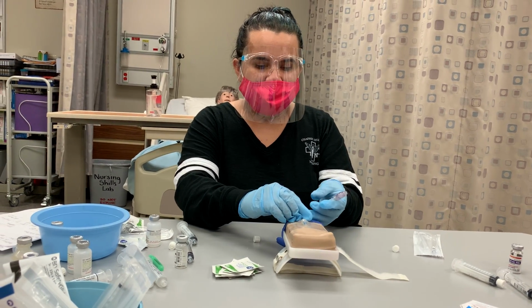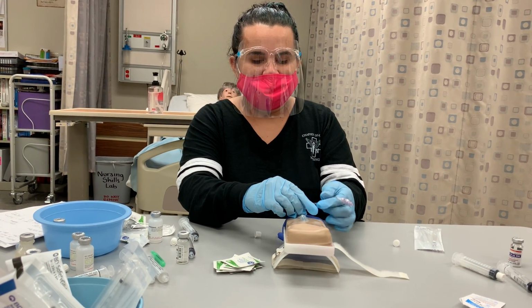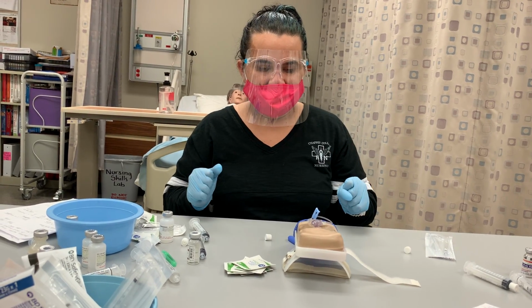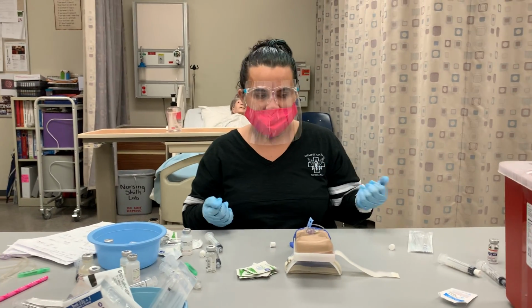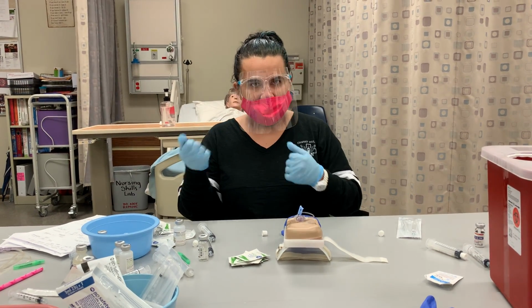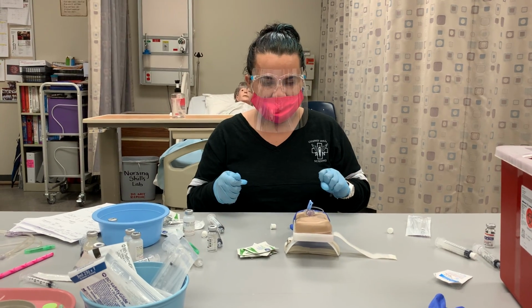So from here, I would clamp the IV site, and then I will say, Mr. Smith, we are done with your medications. If you have any questions, you need to reach me, please go ahead and press the red button outside of your bed or on your remote control, and I'll be here as soon as possible, okay?